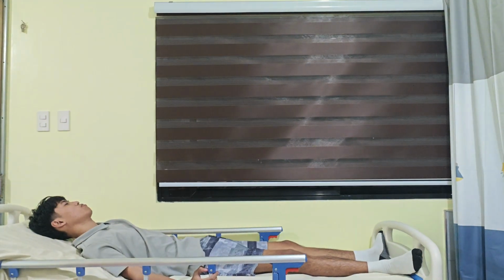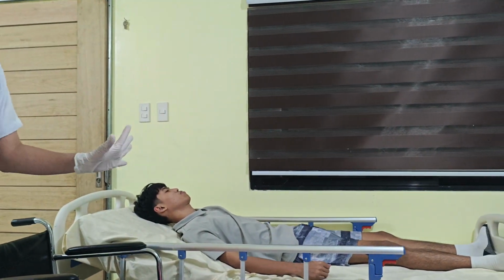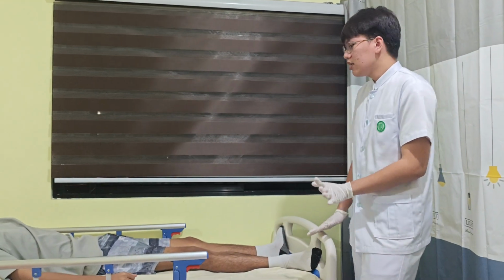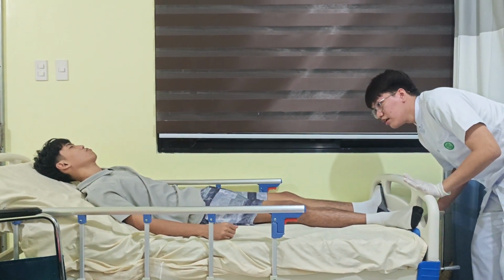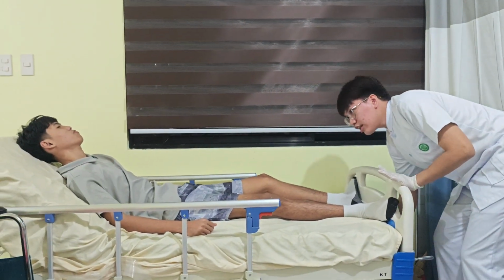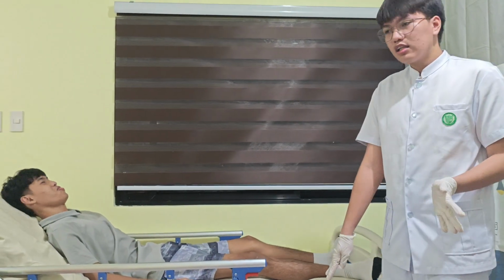Let me just push the chair in here. Close the bed. Now, I'm going to provide privacy for the patient by closing the curtain. After that, I'm going to lower the bed as much as possible and also lift the head of the bed. After that, I'm going to make sure that the bed brakes are locked.